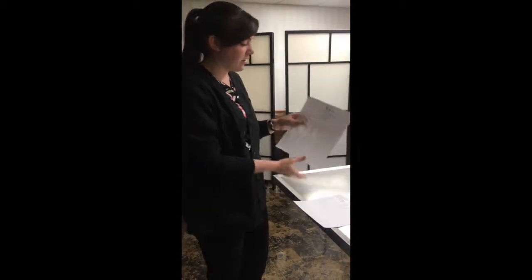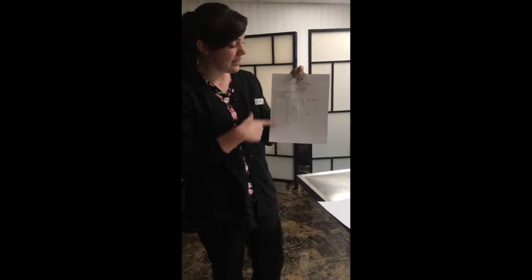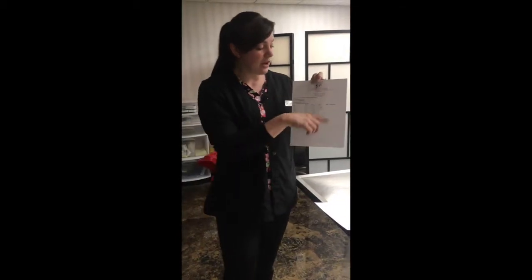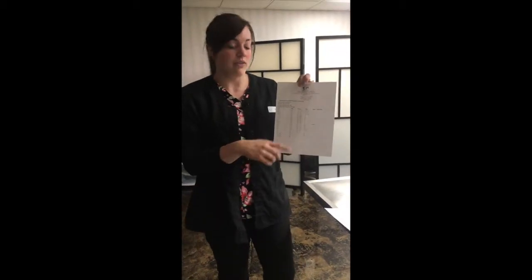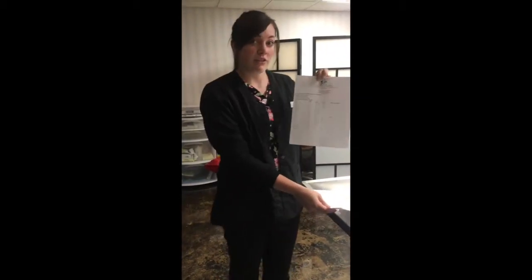We have two different sheets here. The first one is our CBC readings, and this is all of the different reads from the blood. We can see that one of the values was high, and we would go ahead and let the doctor know that that value is high. But other than that, it looks really great.